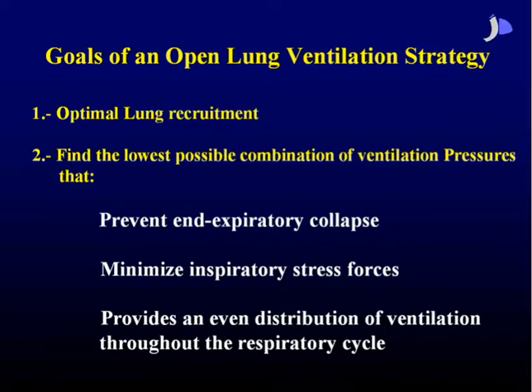If we don't take this into account, just recruiting the lung and trying to make a contest of who can gain the maximum oxygenation, we're submitting the lung to a very high stress, because recruitment pressures can be very high, without the benefit, because this is how our lung is going to be ventilated for hours and hours after a recruitment strategy. In my presentation I will probably repeat this many times, but remember this important goal of an open lung ventilation strategy.